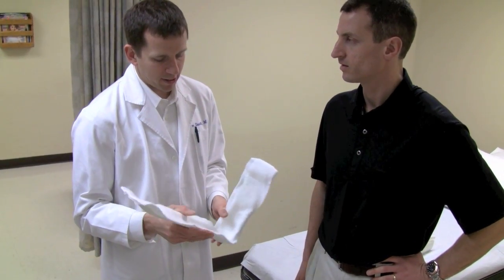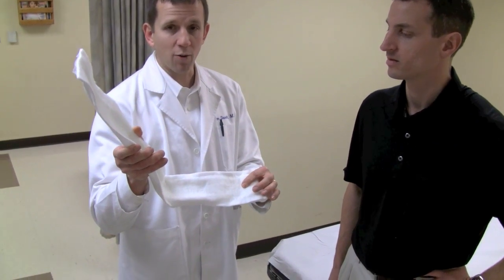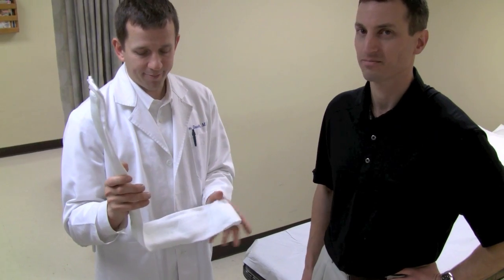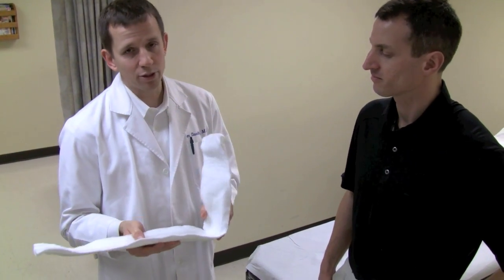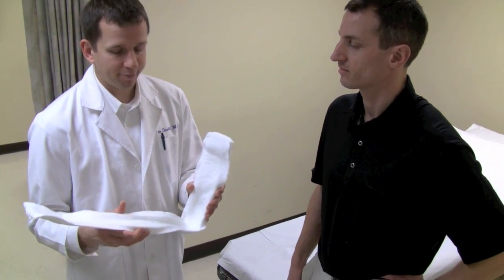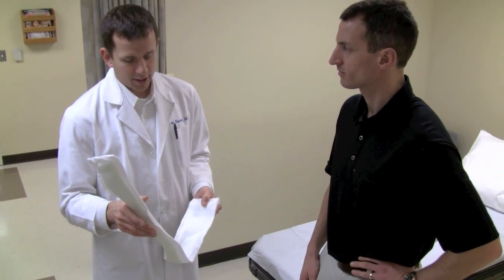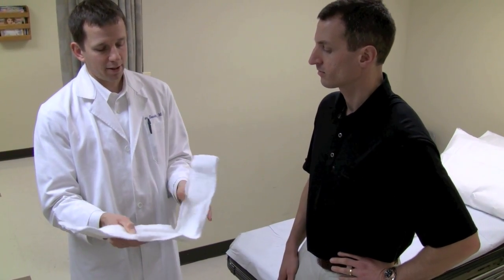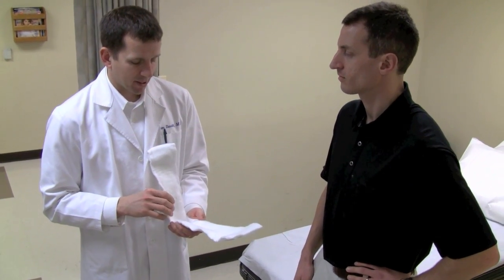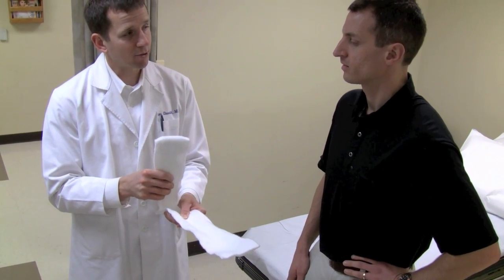The other thing we see sometimes is the splints come in and the foot's in what we call the equinus position, where the ankle is kind of tipped down. One of the most important things about the posterior splints is when you're putting them on for an ankle fracture, foot injury, or something like that, you want to make sure the foot's right at a 90-degree angle. Even worse than keeping it down is wrapping it first with a bunch of cotton with the foot tipped down and then trying to tip it up straight afterwards.